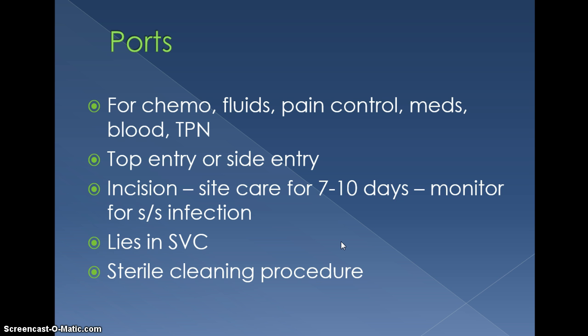Remember that a port can be used immediately after it's placed, but because of swelling and tenderness, it's usually not used for 7 days. 72 hours is a good time frame, but most physicians don't want it used for at least 7 days, so that the patient is comfortable with it, the swelling has decreased, and there's no pain associated with it. Makes it more comfortable for the patient then.